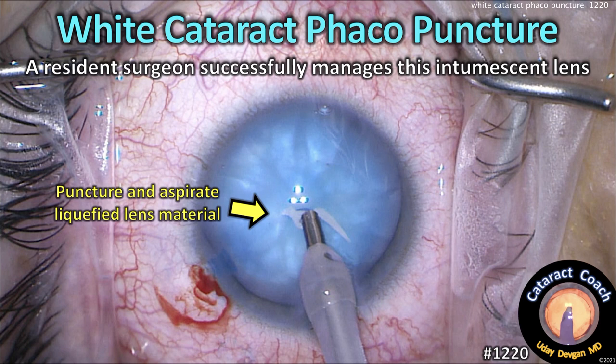CataractCoach.com, white cataract phacopuncture. We've got a resident surgeon successfully managing this intumescent lens.